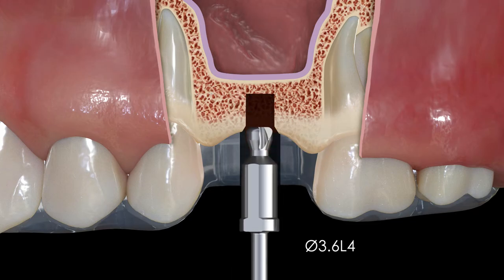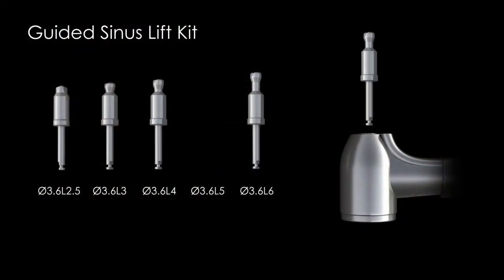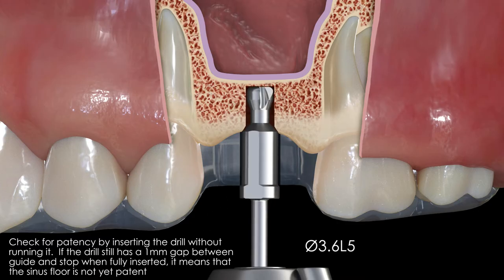Once you get within 1 millimeter of the preoperative bone height measurement, it is recommended to begin checking for patency of the sinus floor with each drill prior to running it. For this example, we should begin checking for patency with the 5 millimeter long drill. Insert the 5 millimeter long drill through the guide as deep as possible without running it. If the drill bottoms out and there is still a 1 millimeter gap between the drill stop and the guide, then you know patency has not been achieved. Begin running the drill until the stopper does bottom out.